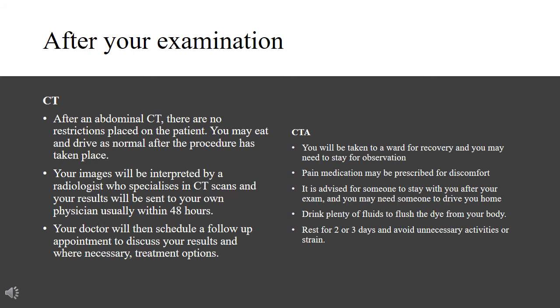Drink plenty of fluids to flush the dye from your body, as the contrast is excreted through urine. Avoid unnecessary activities for 2 to 3 days after the exam to avoid reopening of the wound.